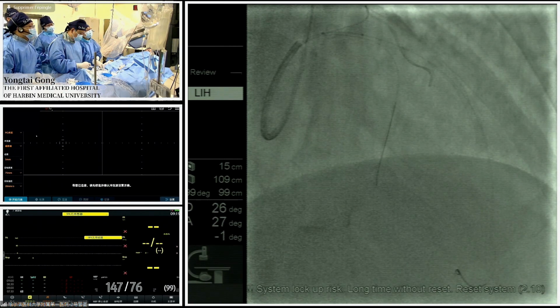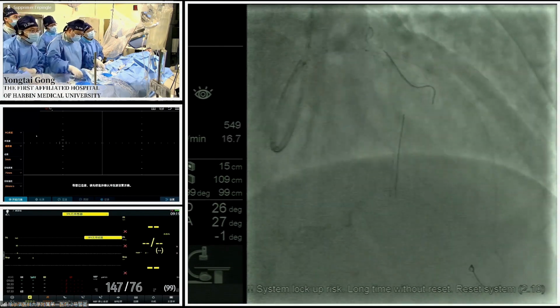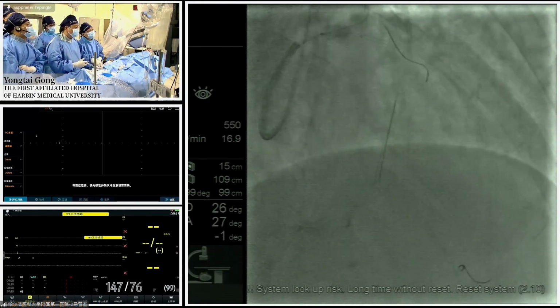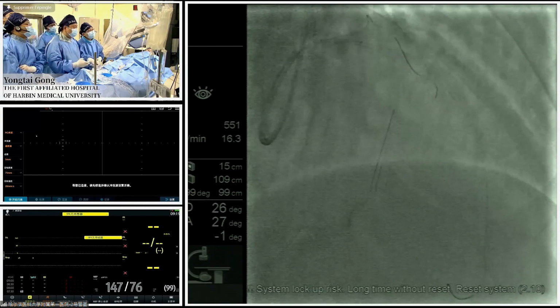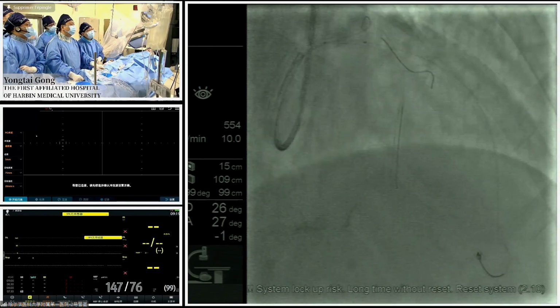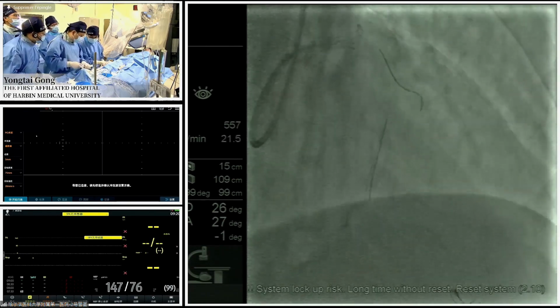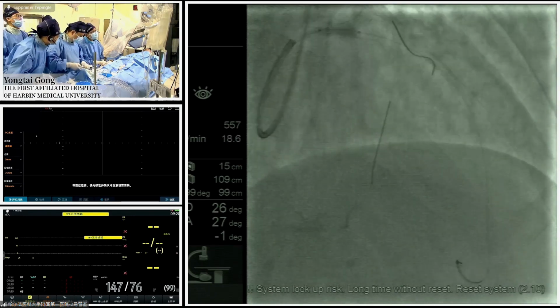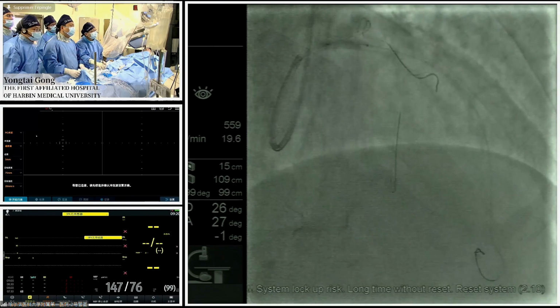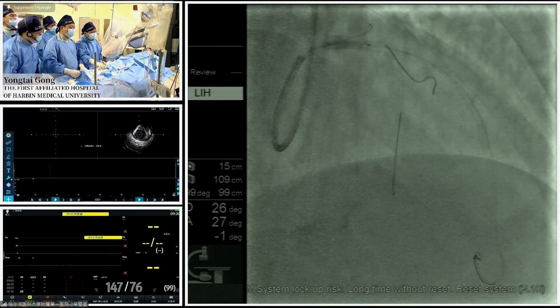For the treatment of calcification, besides IVL, there are other techniques like rotational atherectomy or some dedicated balloons. So for this patient, you prefer to use IVL. After the IVL, we have to run the imaging test to see the results. As the IVUS shows, there is some superficial and some deep calcium lesion in the LAD. We choose the IVL shockwave balloon to modify the LAD calcium lesion.